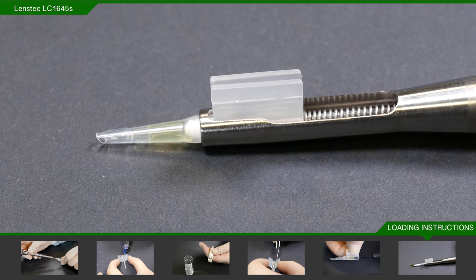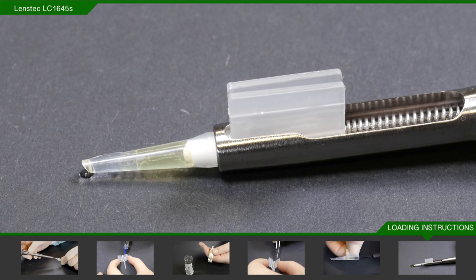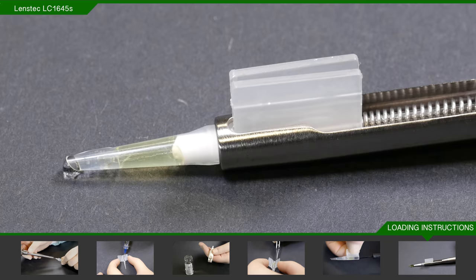At this point, withdraw the plunger about 5-8mm and quickly plunge it back so that it is butted up against the trailing haptic. This will ensure that the trailing haptic is not trapped. If you are not sure, please repeat the process. This is important as it is the final safety check before you inject. You are now ready to enter the incision.